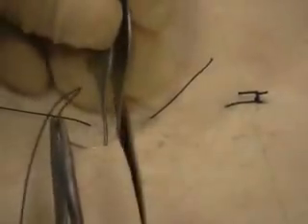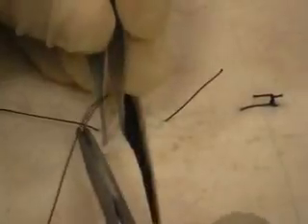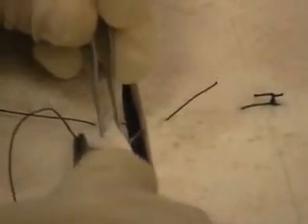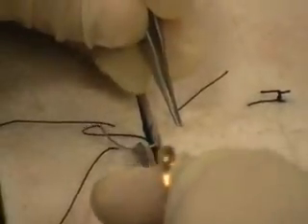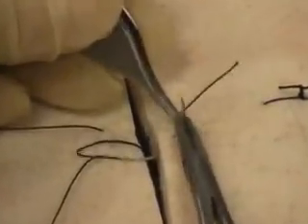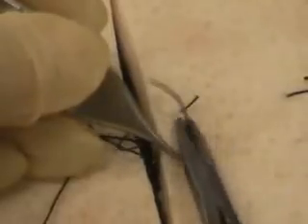I'm just going to adjust how I'm holding here a little bit and try to see where I'm coming out. This might be a little tricky. I'm going to reload again right here. Use my forceps to hold the tissue up if I need. Your forceps really are here to help you. We're going to try to avoid touching the very tip or the point. Okay, and when we pull this, there we go, and make sure we didn't get too much of our tail there, you'll see that we have something that looks kind of like a little box.